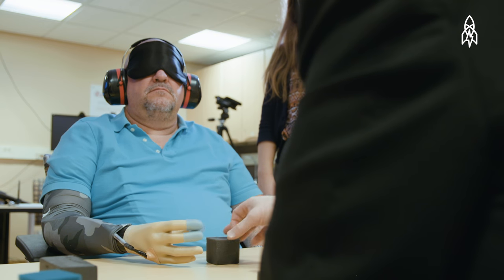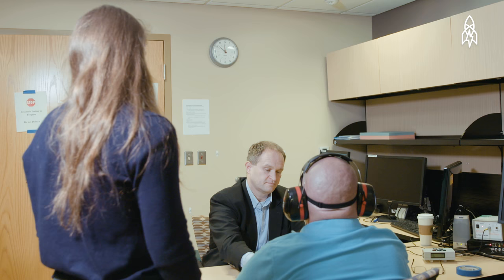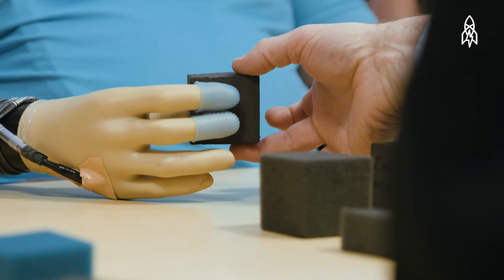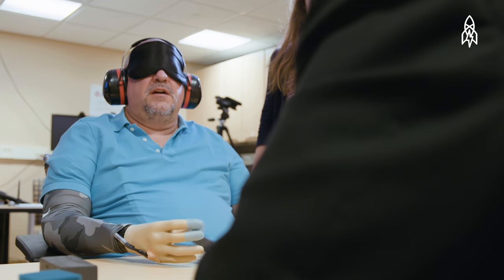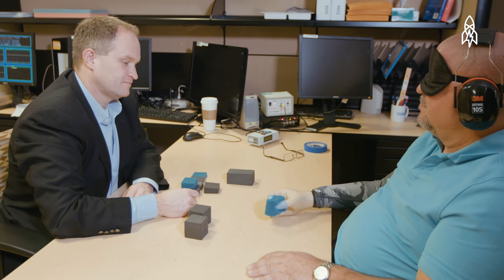Soft big block. The first time they put sensation on, everything was just incredible. It was like, wow, I could actually feel an area in my hand, a certain area tingling and vibrations and stuff. Small soft block. It's just an incredible feeling.